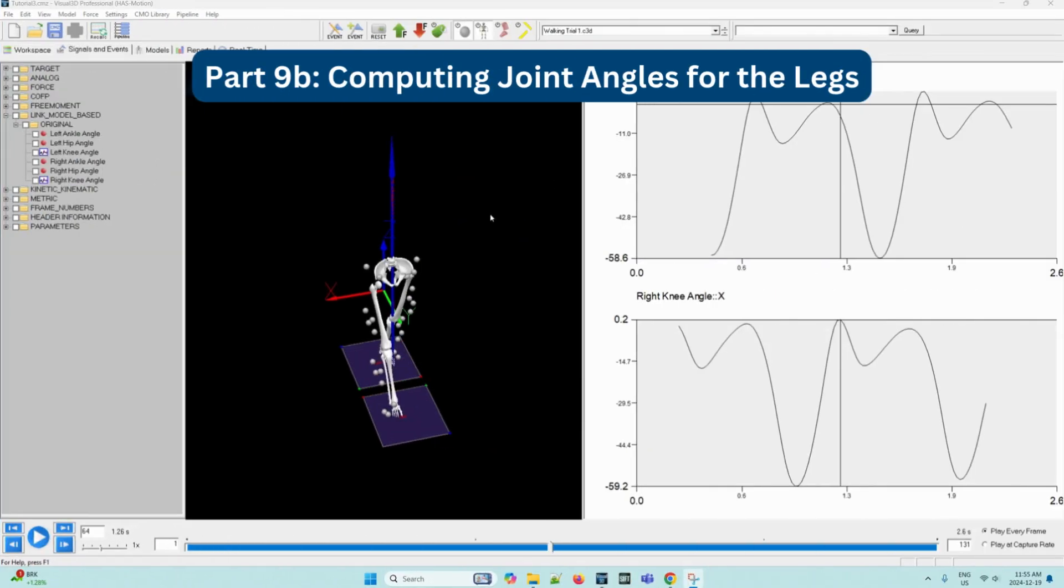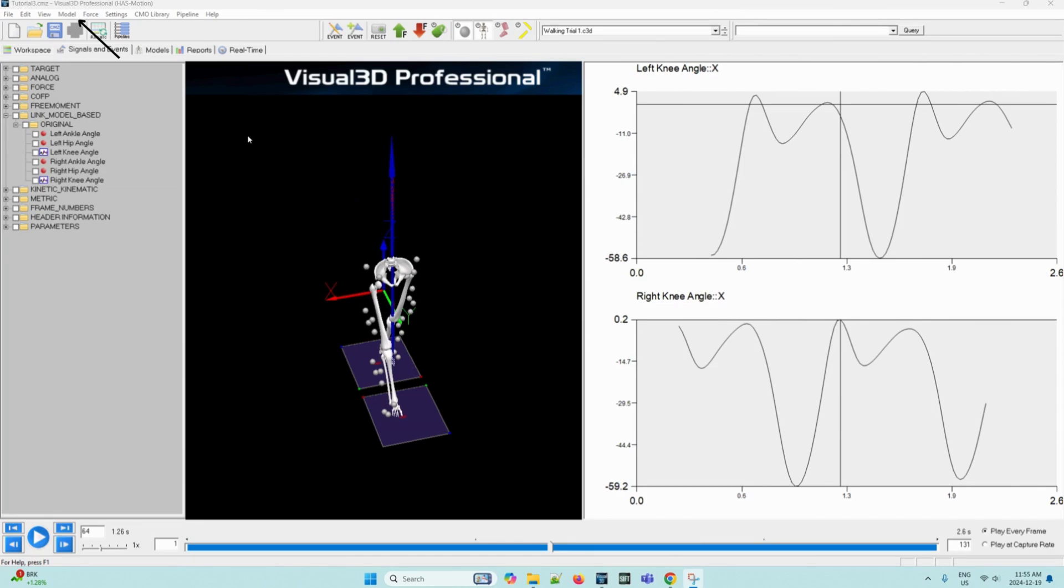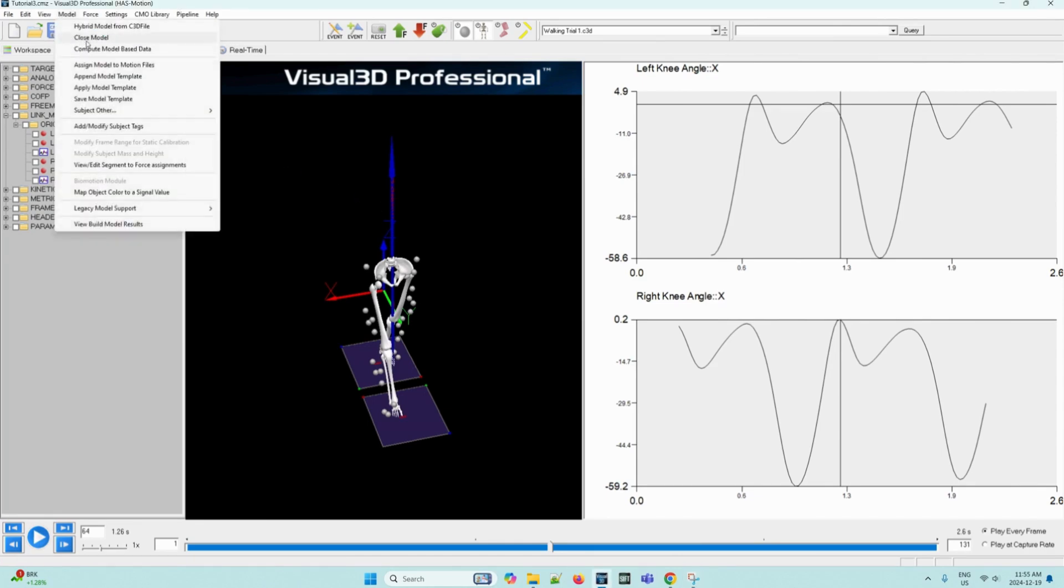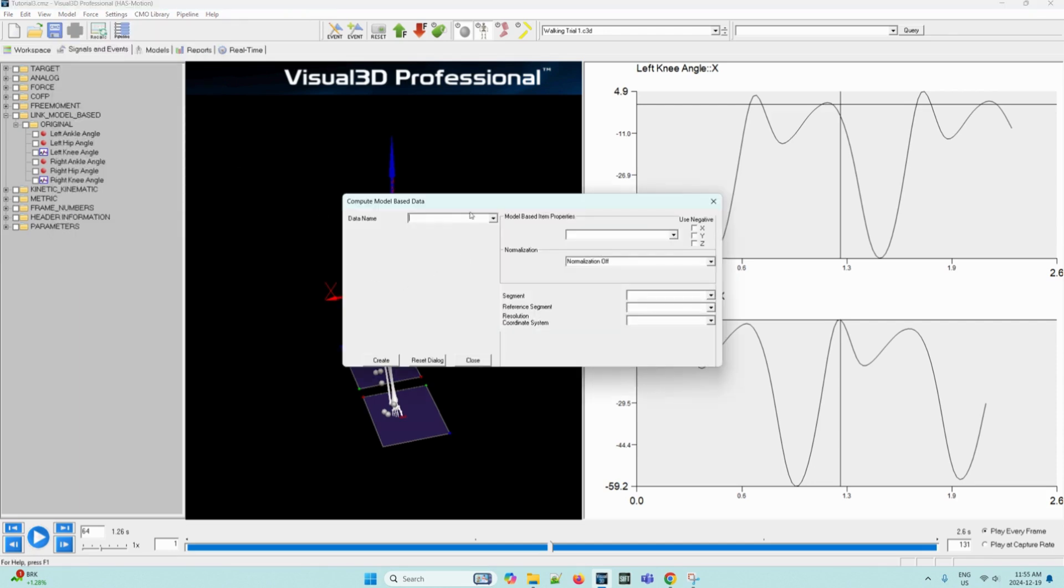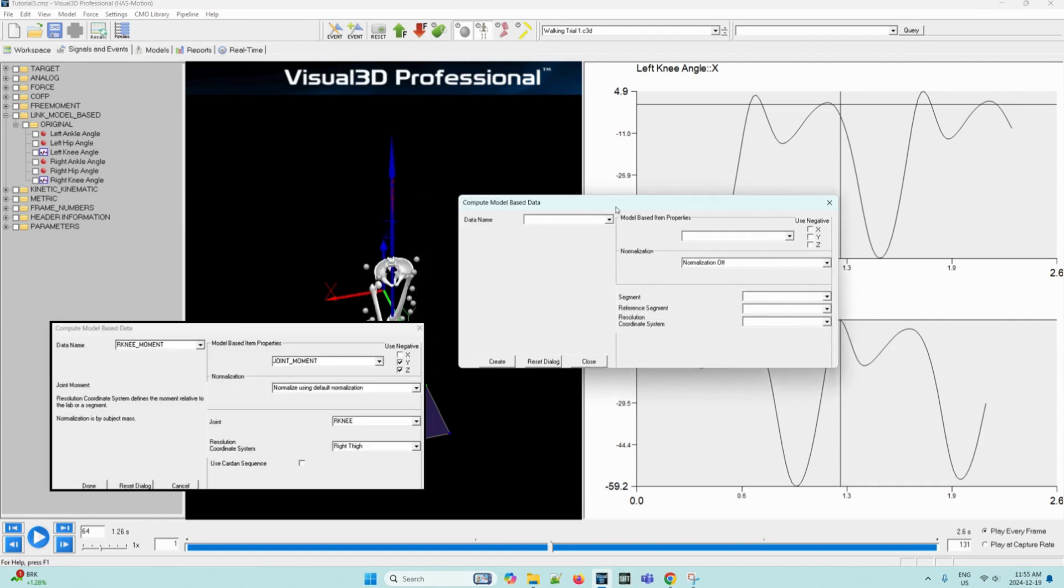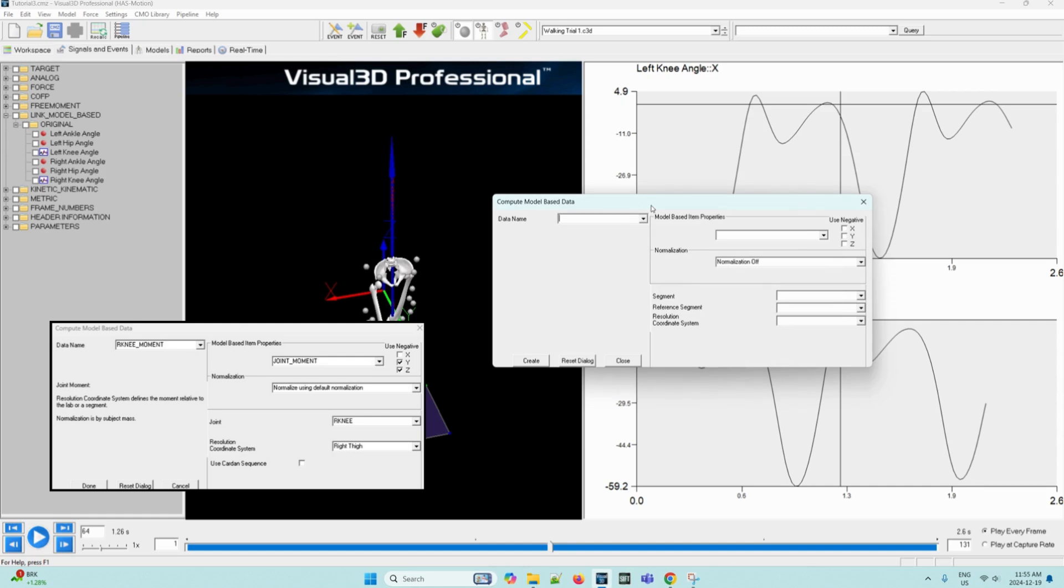We can then navigate back to the Visual 3D application to create the net joint moment for the right knee. So we can navigate to the model drop down menu and then once again select compute model based data in order to open the same dialog box. We can reference the image which contains one definition of the right knee moment. So in this case, the data name box can be filled out as r knee underscore moment. In the model based item properties drop down, we can select joint underscore moment this time, and then we can also check the use negative checkbox for the Y and Z signals.